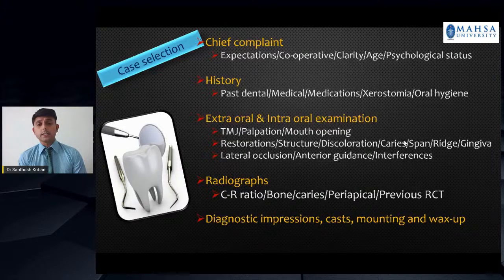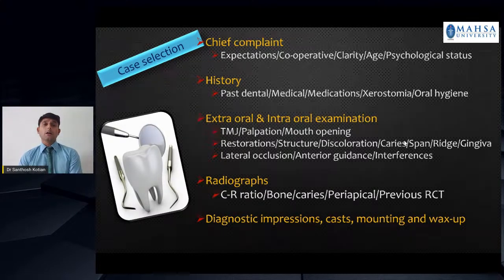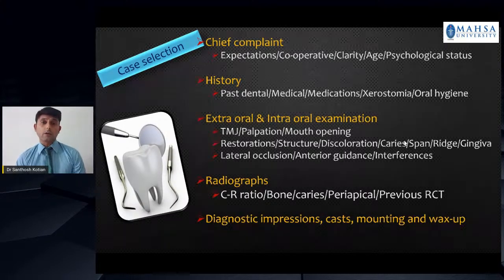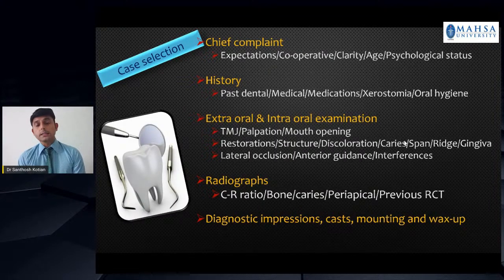Once you have a diagnostic cast, you have the patient's original record of their dentition with you, which is very, very useful in case of any future problems, any differences in understanding between the patient and the dentist. It serves as a good record of how the patient's teeth were. Plus, it is very, very useful in patient education, as well as in treatment planning.